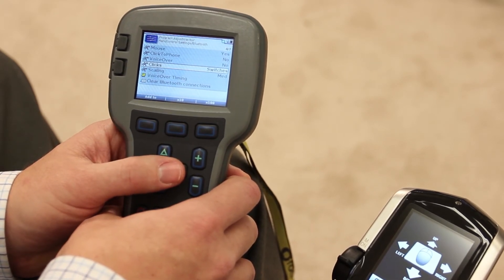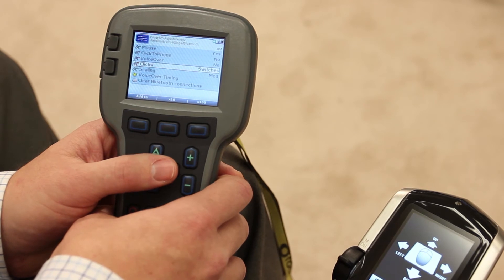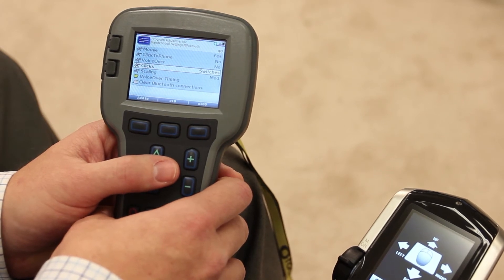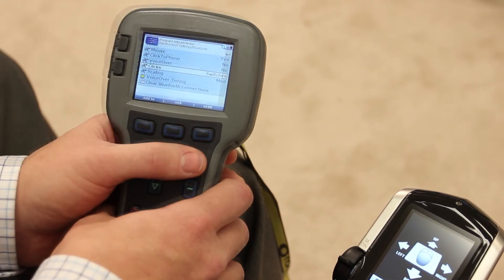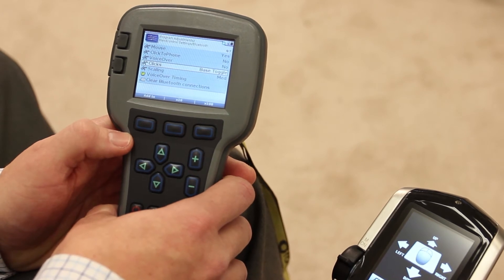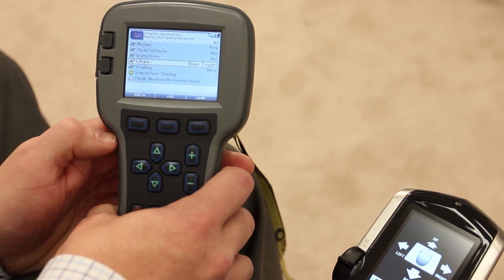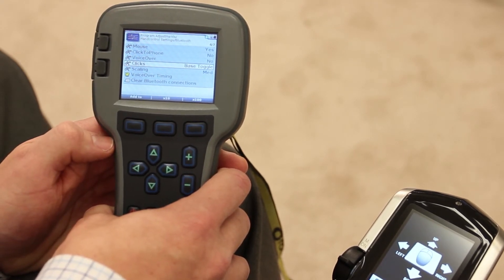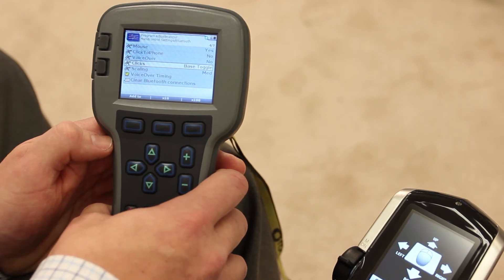The first choice is switches. This requires that a mouse click PTO harness be purchased from Quantum Rehab and plugged into the power module. This device allows us to plug external one-eighth inch jack switches into the harness, and these switches can be utilized for mouse clicks. The next choice — hit the plus key on the programmer — is base toggle. This uses an external left mouse switch from the power base, using the mouse click PTO harness to toggle between mouse movements and mouse clicks.